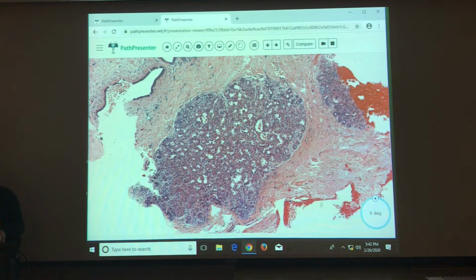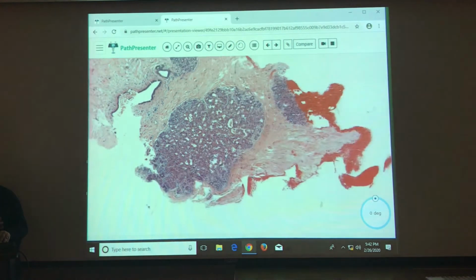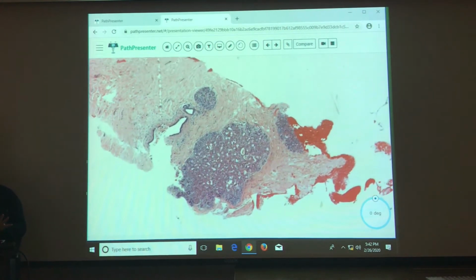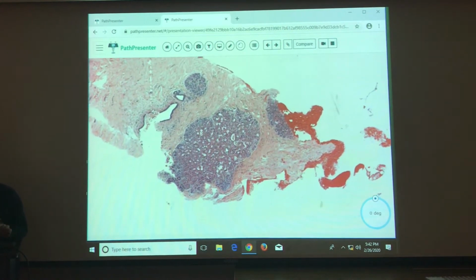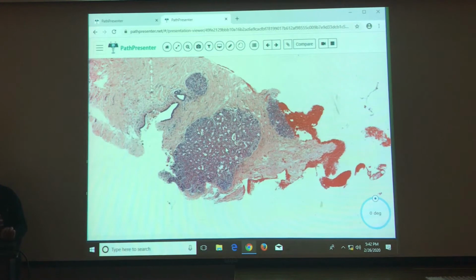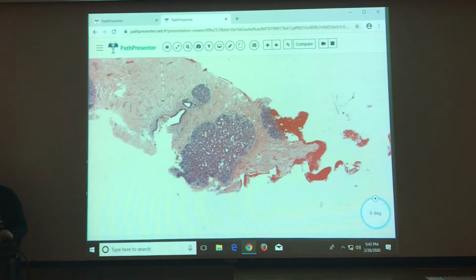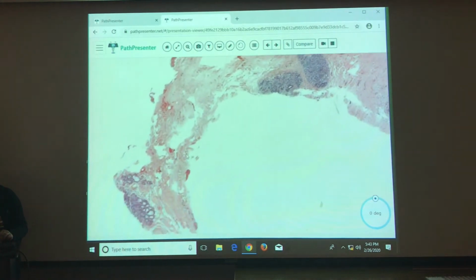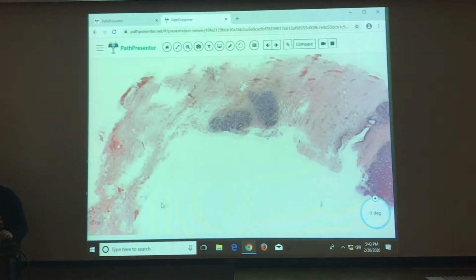So this is where it's more vacuolated. It's maybe not the best fixation because it's kind of falling apart. But you'll see when we go to MGA, that's a hint, how it looks a little different. It has a papilloma impression for me when I first look at it.